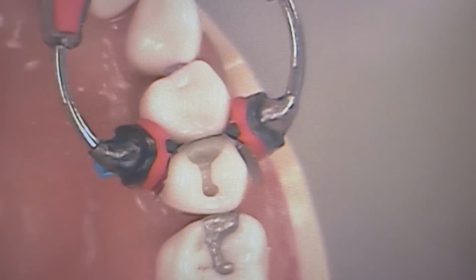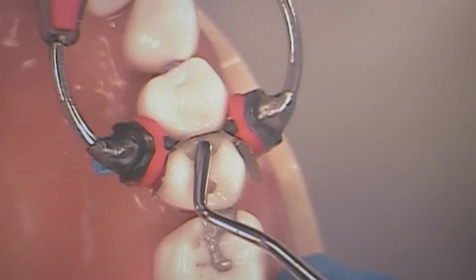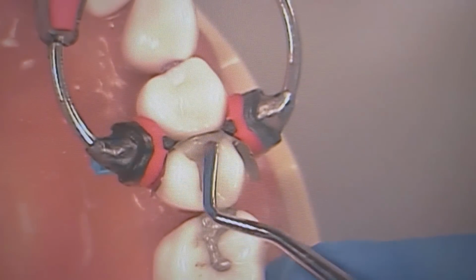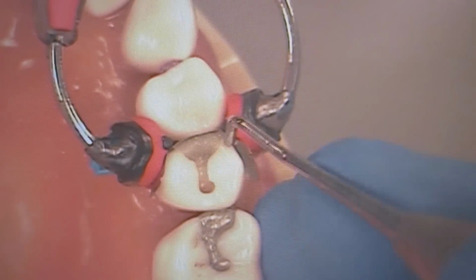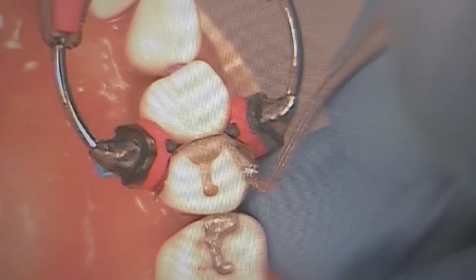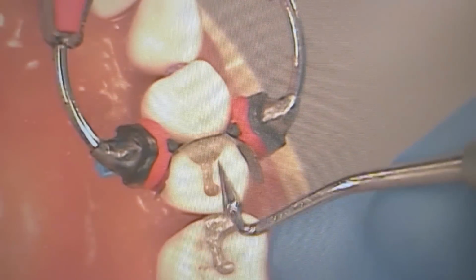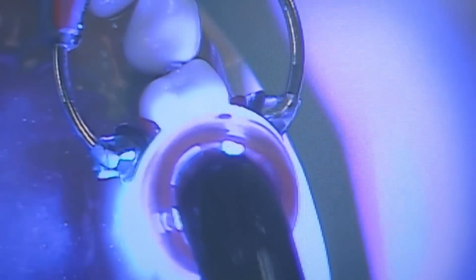Smoothing out. The marginal ridge is still looking a little high to me. So the marginal ridge is looking a little bit high right now. Just going to shape it. Using the paddle tool to continually shape it. I'm using this instrument to plump up the marginal ridge. Okay, using the cylindrical tool to plump up the marginal ridge. More shaping, more removing of excess. Efrain says it looks beautiful. Light cure of the third layer, the marginal ridge layer. He's using the technique called guesstimation.